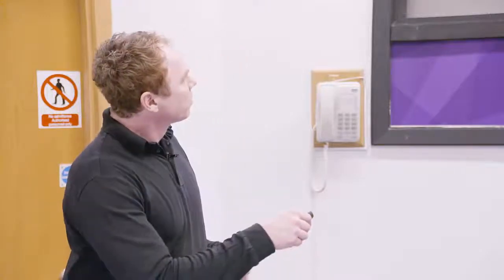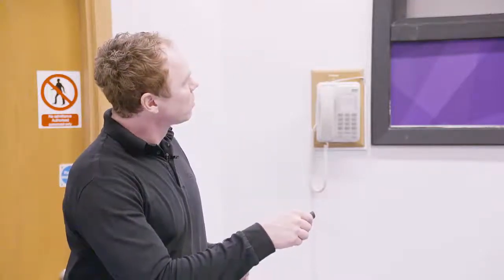Of course, it depends on the quality of the muscle, but the whole thing is usually over within 300, 400 milliseconds. With the displacement sensor, which is placed over the belly of the muscle that we are measuring, we are monitoring the deformation of the muscle belly in radial direction. And as a result, we will get a time displacement curve that I will show you in a minute.